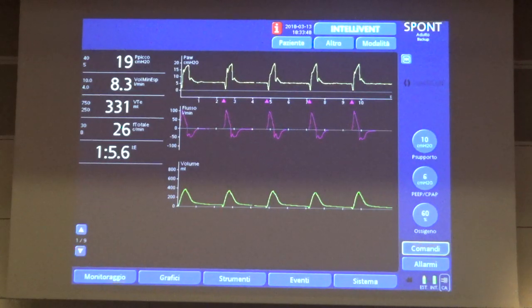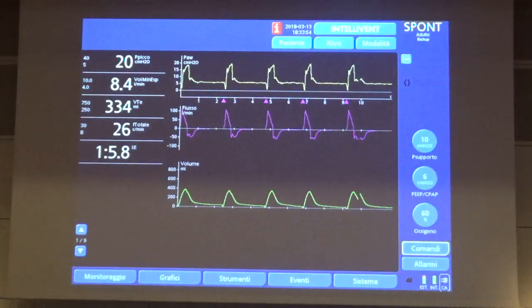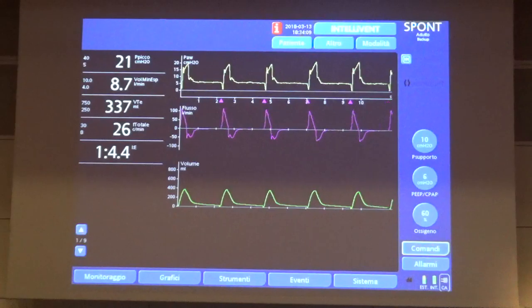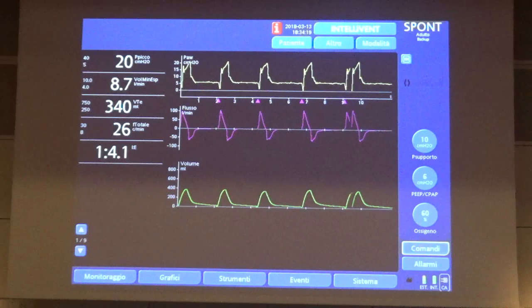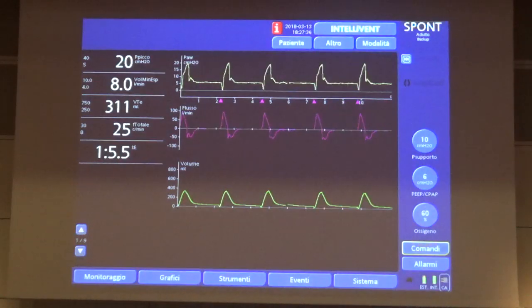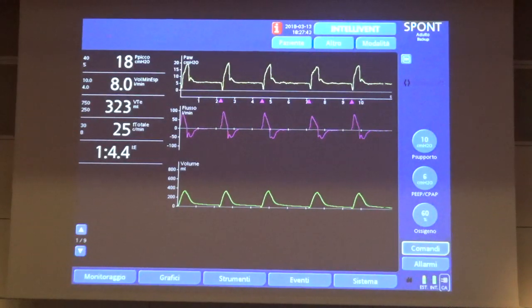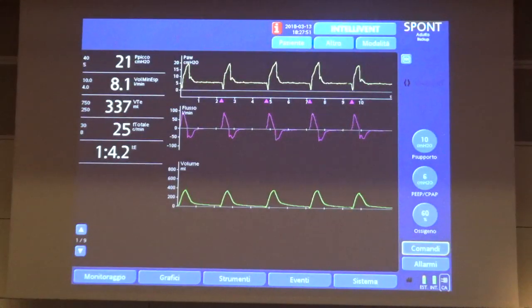The same in the case of a restrictive patient with clear early cycling. We can adjust the sensitivity of the expiratory trigger, in this particular case moving from the default setting, 25%, down to 5% of peak inspiratory flow, and it is effective. Or, as an alternative again, select this new function on mechanical ventilators, a waveform-guided cycling valve.